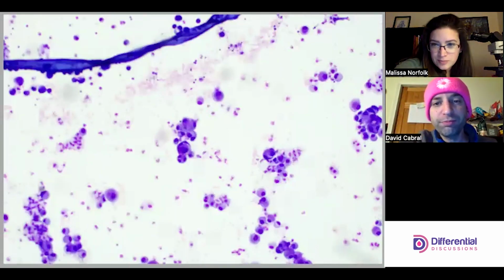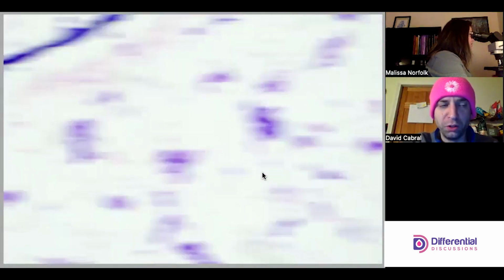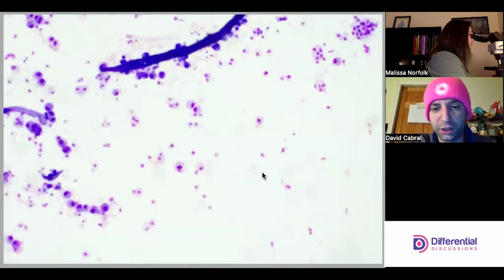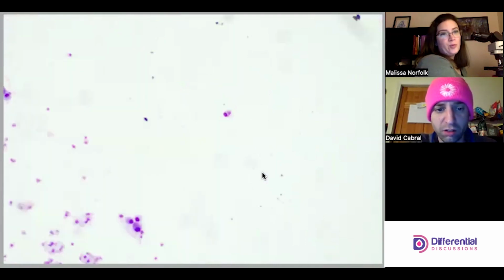It looks like there's some, yes, there might be some leukophagocytosis. Leukophagocytosis is something that we typically note, and it's normal physiology for monocyte macrophages to ingest white cells, as a means of the cleanup crew. But with so many big dark malignant cells, it could also be that abnormal process too.